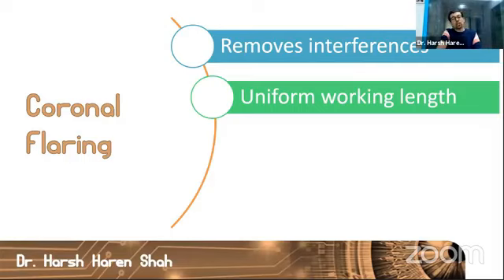Coronal flaring also makes sure that the working length that you had established does not change. Why do I say this? In case you establish the working length before coronal flaring, you just locate the canals and you straight away jump for establishment of working length.